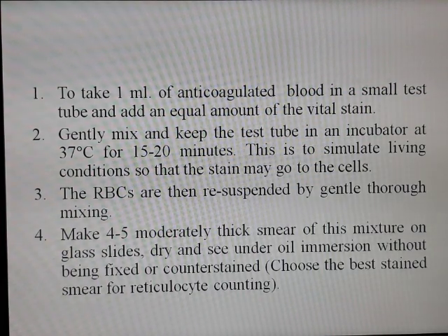Now we should gently mix the blood with the supravital stain, and then we need to keep the test tube in an incubator at around 37 degrees centigrade for 15 to 20 minutes. This is to simulate living conditions so that the stain may go into the cell.